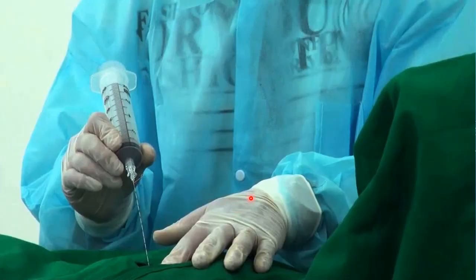Another example from the internet, this time the pericardiocentesis needle is being held rather impressively like a dart, but again all the same concerns about your control and about how you're going to make that needle bend apply. This is not the right technique.